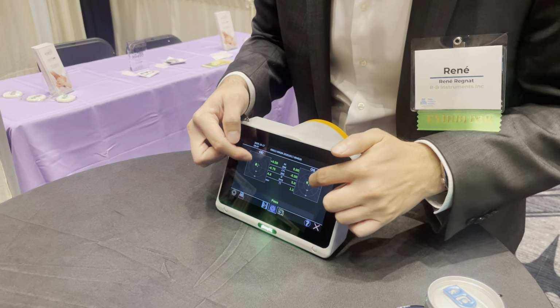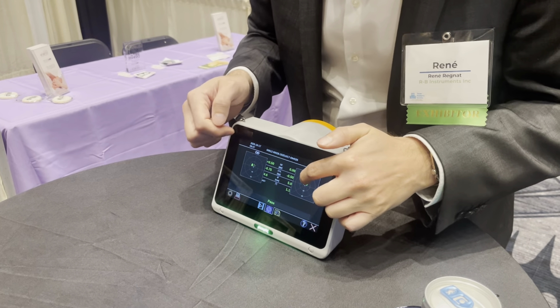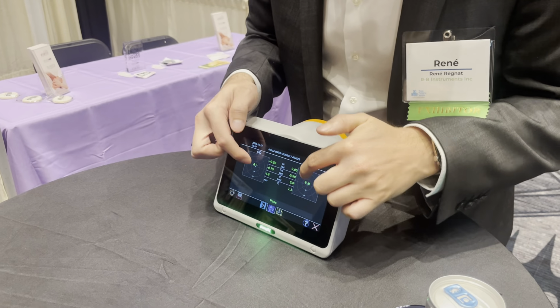This is all those green dots here. And I was looking away, which is why we see that shift here. But the green dots, every green dot has a corresponding green dot on the other side. That's one measurement. That's one gaze where I looked at. So when I look at you, for example, and I look up, you will see a lot of dots in the end up here. So it tracks my eye movement. Okay. And this, in the end, shows me then, do I have a symmetric gaze or an asymmetric gaze? Exo, eso, or just one eye?